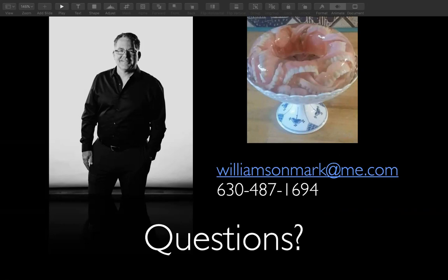And so sometimes that wasn't in the plan, right? They're like, well, this patient's already paid and this is what we're getting. This is why I like doing these fully guided systems or working with surgeons that understand that and make sure that we get enough restorative space at the end, so it's not a headache for the restorative doctor. Typically it's not an issue for the surgeon, right? Because the implants are put in properly, but maybe there wasn't enough bone taken away. So now it becomes an issue.